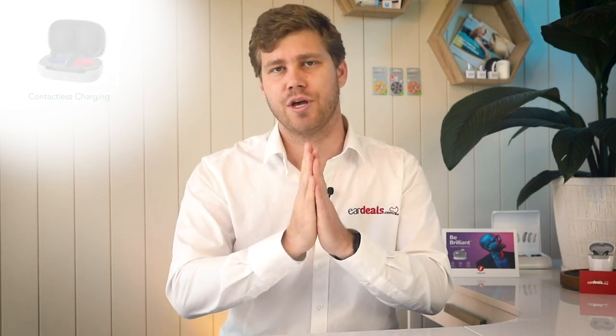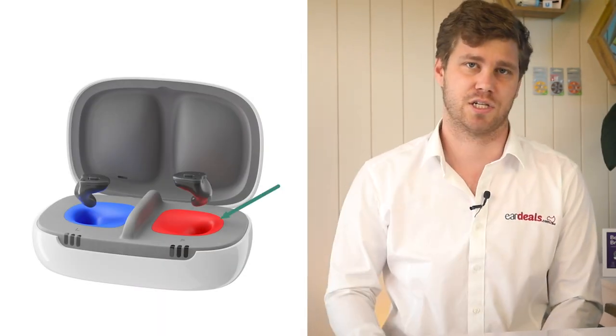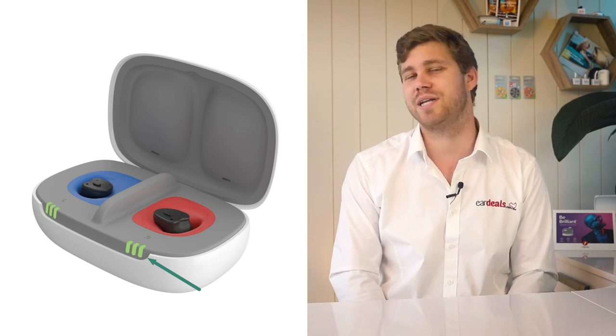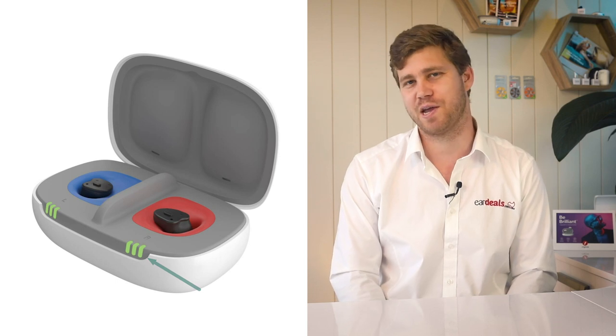One exciting feature of the new charger is that it's contactless, meaning you don't have to match a contact point on the hearing aid with the charger to get a stable charge. You simply place the hearing aids into the charging wells for left and right. Signia has addressed two key areas here: dexterity issues and eyesight. Even without your glasses, placing the hearing aids into the case is easy, and indicator lights on the charger show where each hearing aid is in the charging cycle.